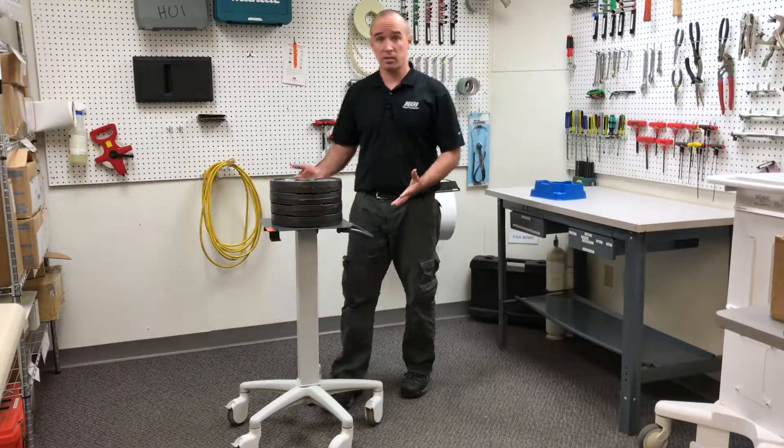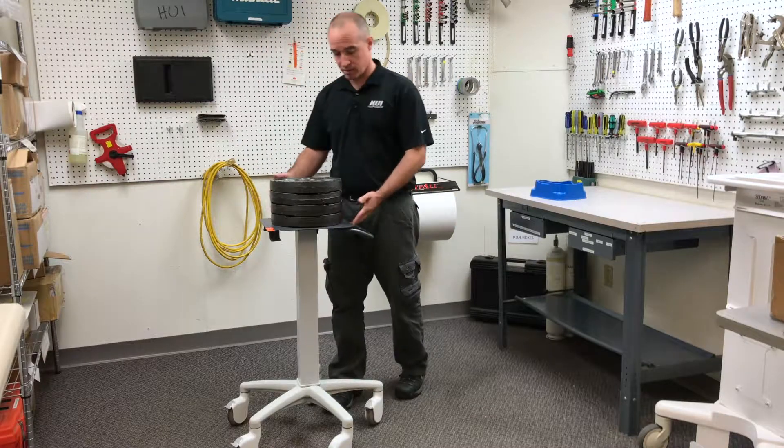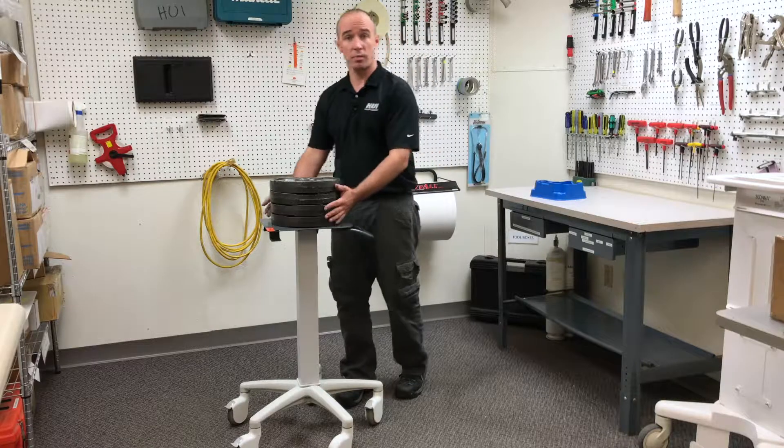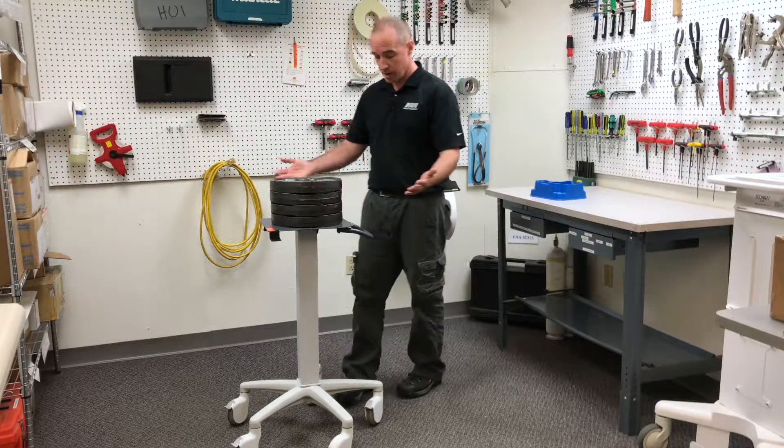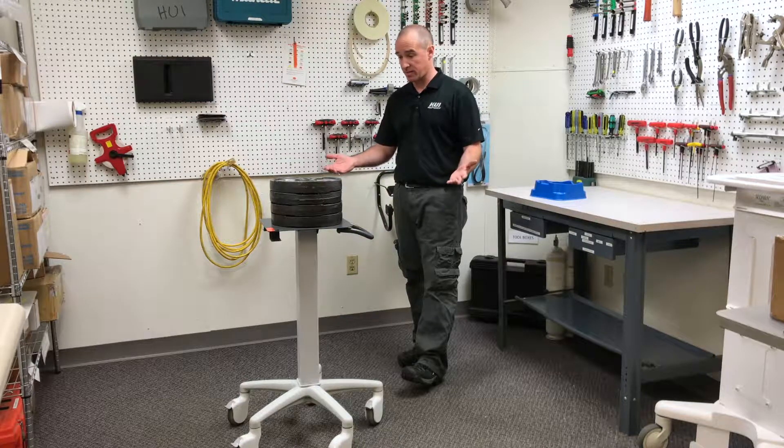This cart was designed for a load no more than 25 pounds, as it states on the warning sticker on the top here. So our safety factor of four gives us 100 pounds. We gradually place it on there, give it a minute. If no unacceptable risk presents itself, it passes.